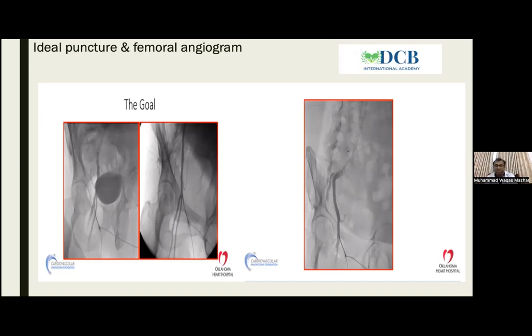Yes, sir. We use the femoral approach whenever we are doing acute stroke intervention in our cath labs. We have 2 cath labs which are dedicated stroke intervention cath labs. Yeah, but that's a different animal. An important suggestion is to always keep an echo Doppler, a duplex scan, in each cath lab in order to facilitate the femoral approach.